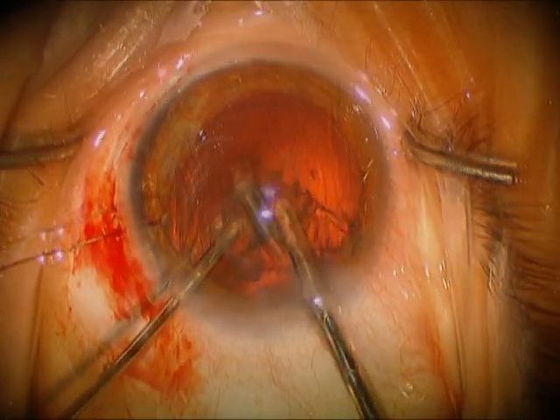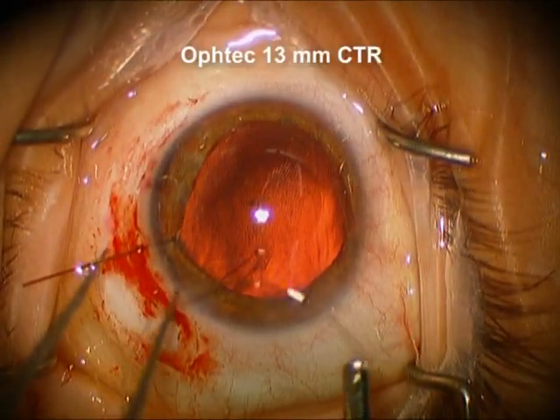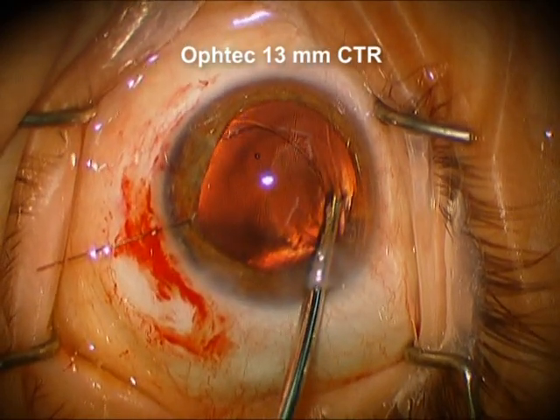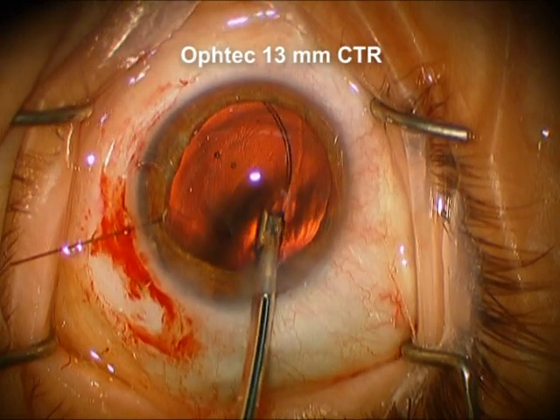Now we're going to remove the residual material with the anterior vitrectomy. We put the cut rate low. Here's an Ophtec 13mm capsular tension ring. We're going to place this, and we're placing it so that the initial tension is away from the good zonules as the ring goes around.